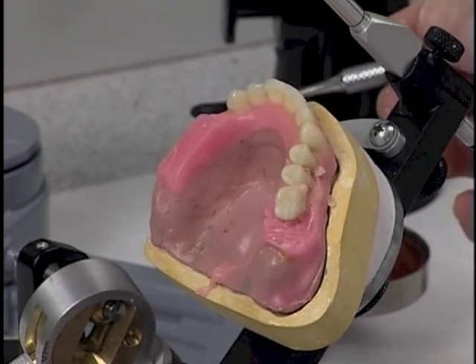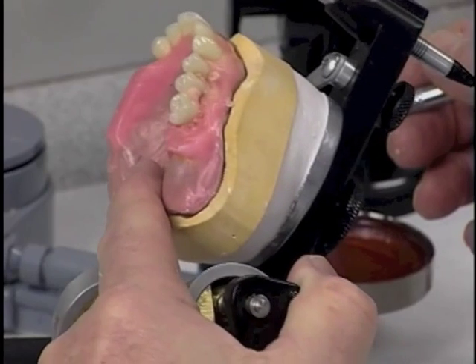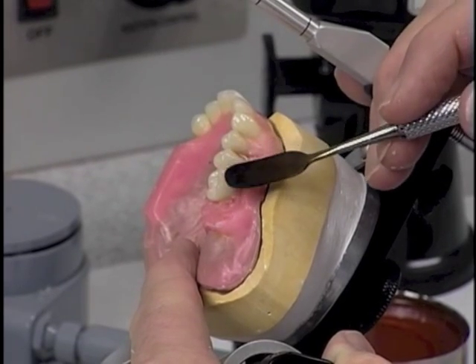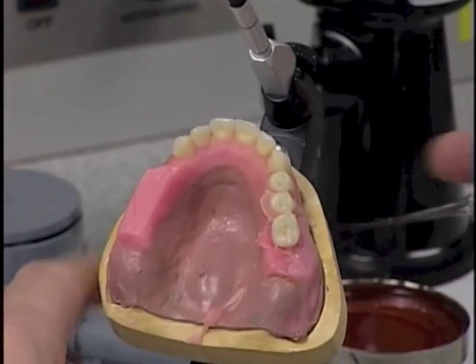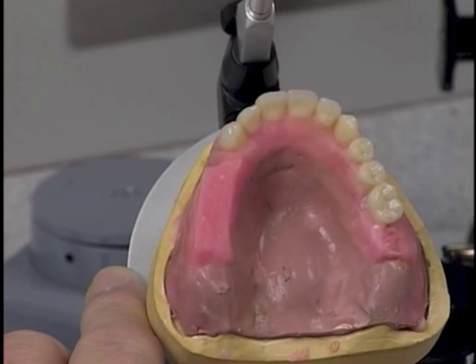Now we're going to stabilize those teeth by melting the wax around them. We need to do that palatally as well as on the buccal.